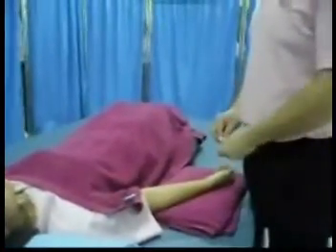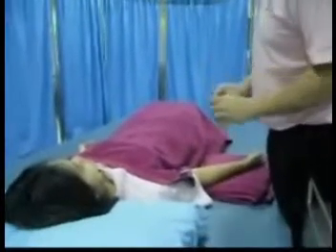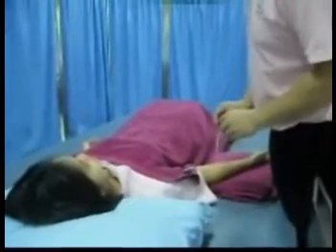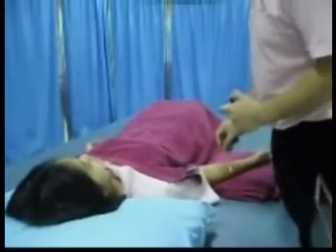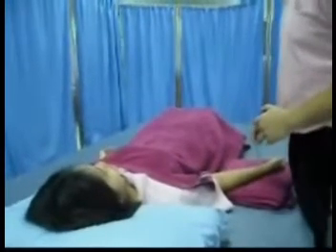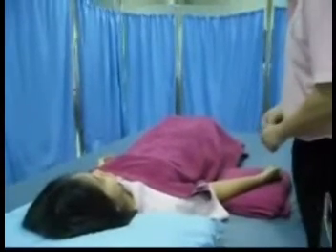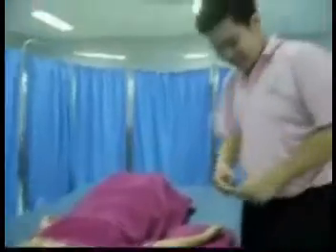And then sharp, and then sharp. Okay. And then I test the temperature sensation. You remember the feeling. Is it cold or warm? Cold. Okay. Warm. Cold. Okay. Check the sensation of the patient.